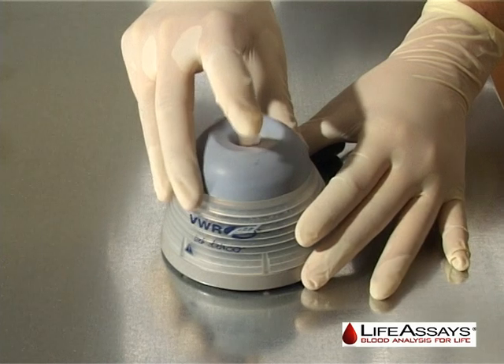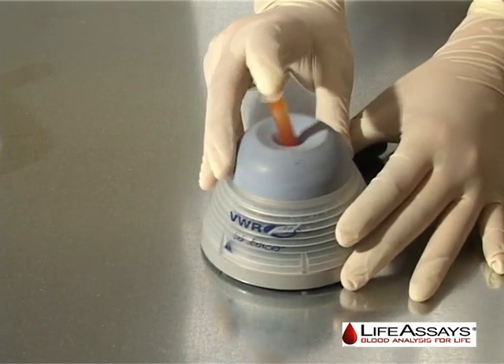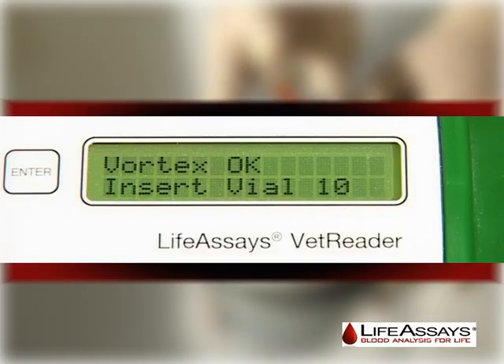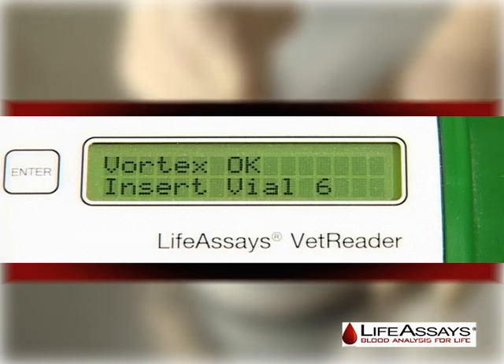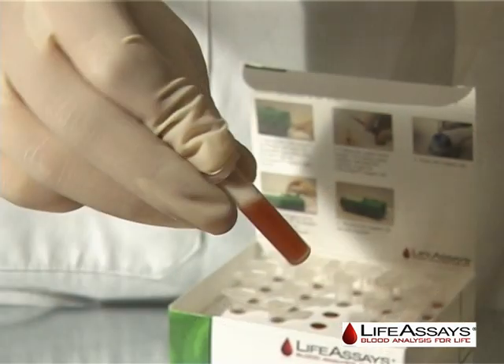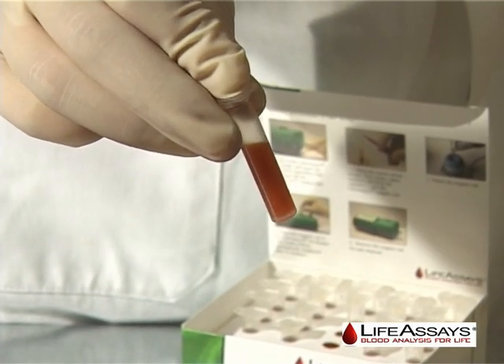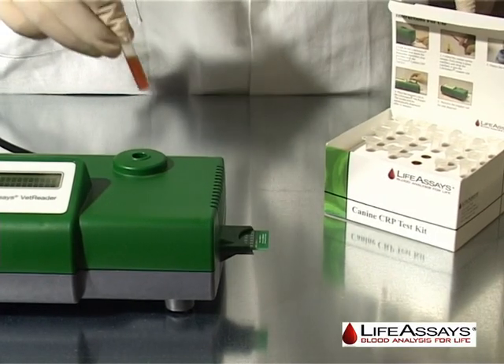Vortex the reagent vial for 30 seconds using the timer on the display. Once the countdown has reached zero, the instrument will display vortex OK. Insert vial 10 will be displayed on the VetReader and a countdown starts from 10 seconds. You may turn the reagent vial upside down and make sure there is no pellet in the bottom of the vial.